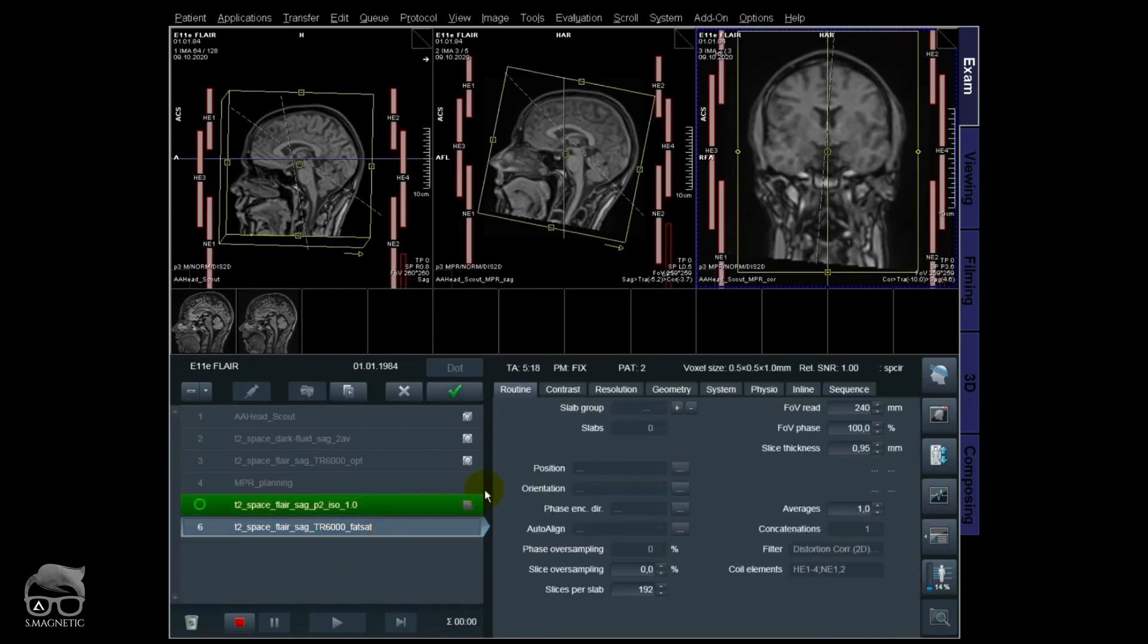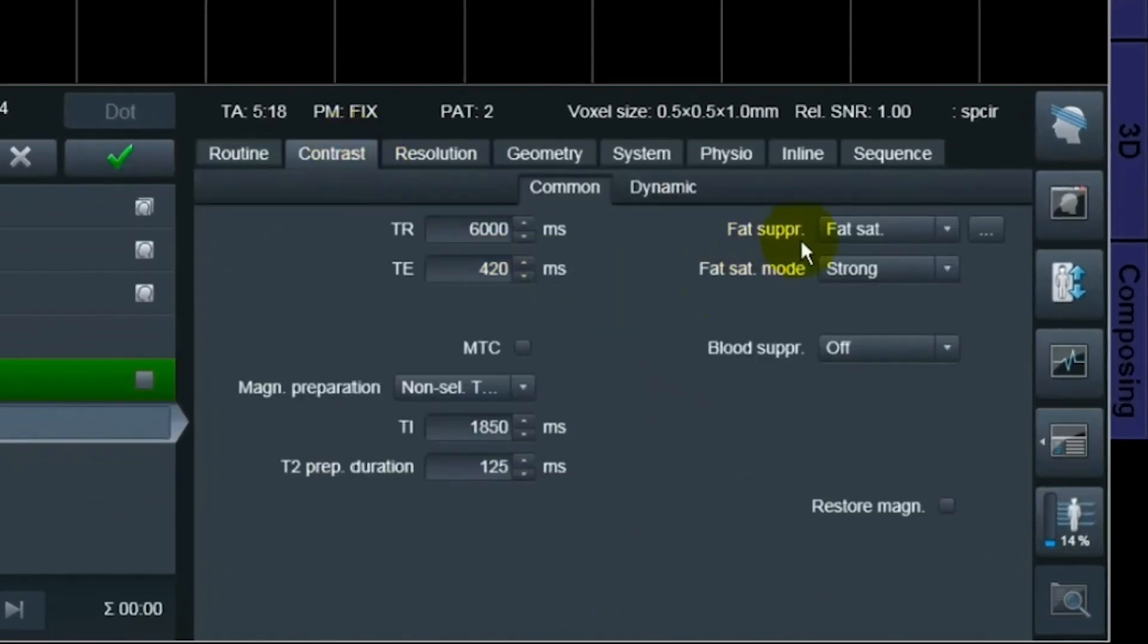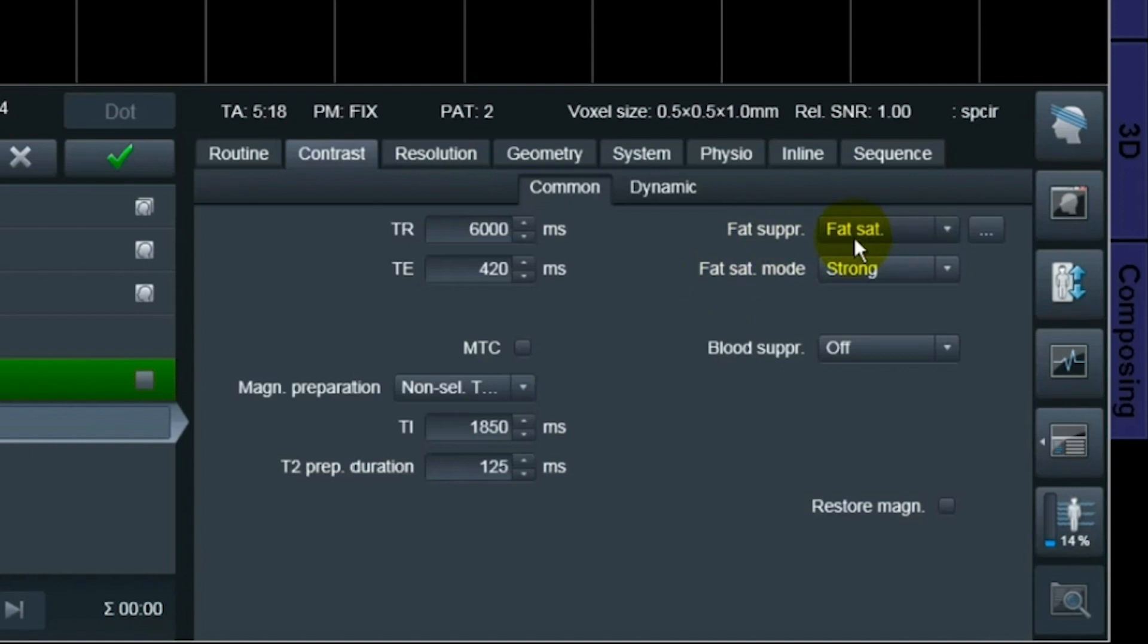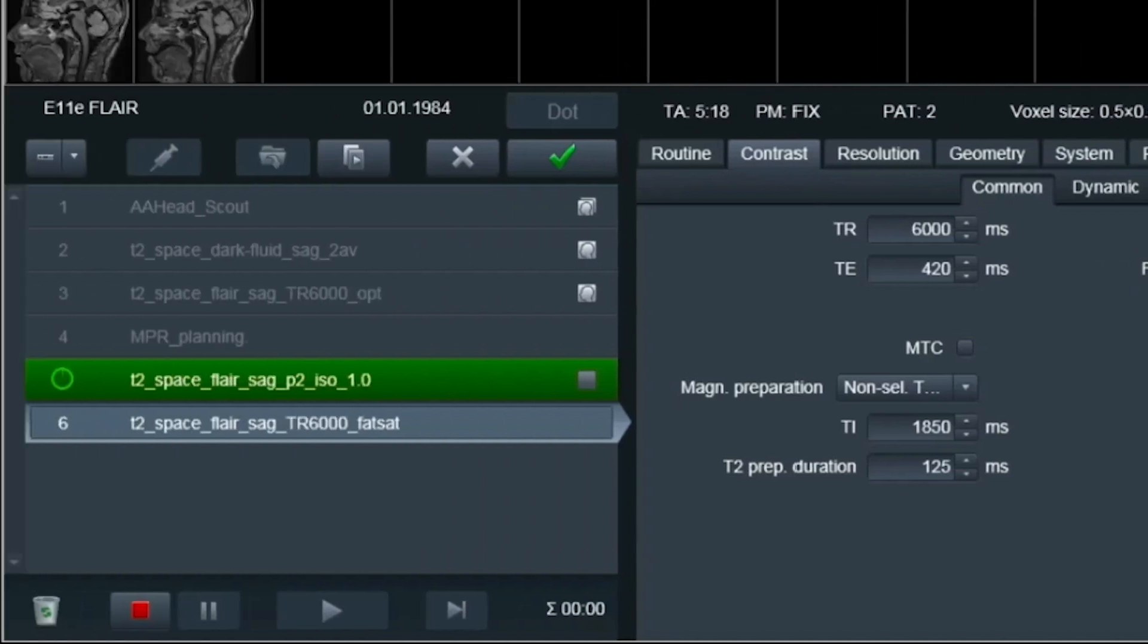This is the same sequence as the one I optimized, the TR of 6000, but I only have a fat sat pulse right on now. It's because standard from the Siemens, which is the number two in line there, T2 space dark fluid sagittal two averages, also has a fat sat pulse. So it'll be easy to compare whenever you have a fat sat pulse on this one as well. I'm just going to scan this one.